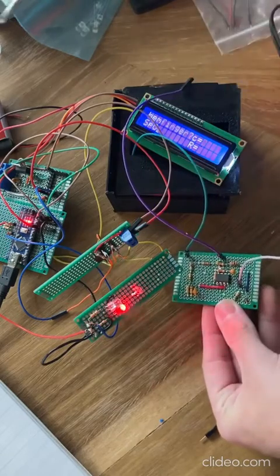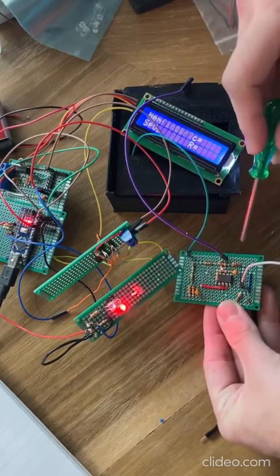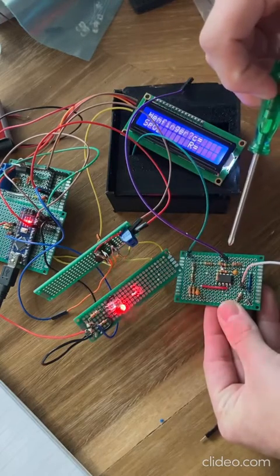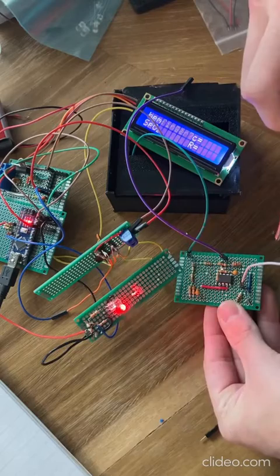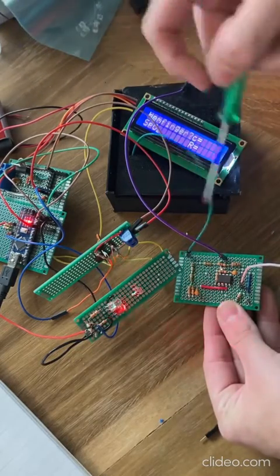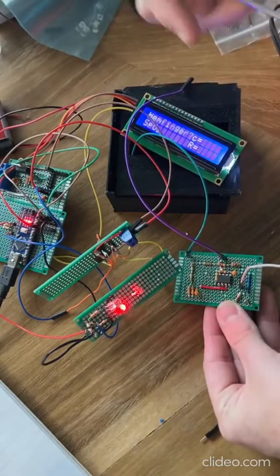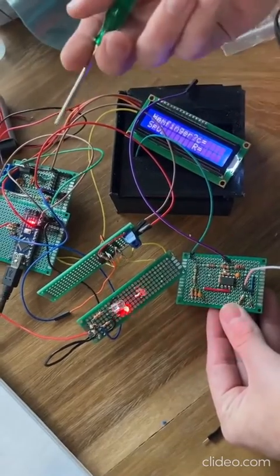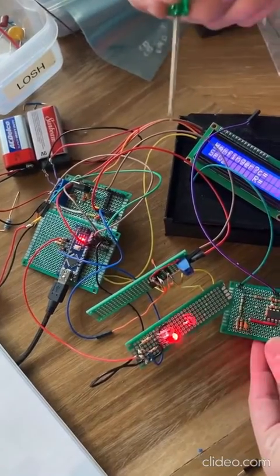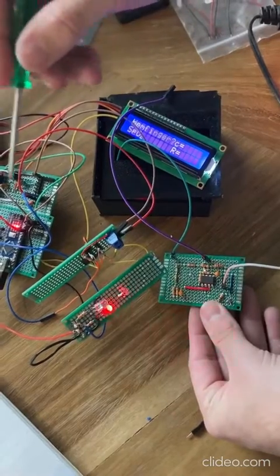So to counteract that, we use a filter, an analog filter, and this is a bandpass filter that Mark made, and it goes from 0.3 hertz to a frequency of 3.6 hertz, and then it outputs that into here. Now, we were having issues hooking it up to the Arduino, so it's not connected in this case. But ideally, it would be connected to filter the voltage signal.